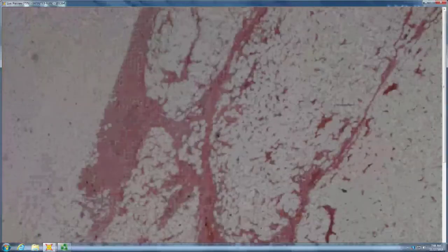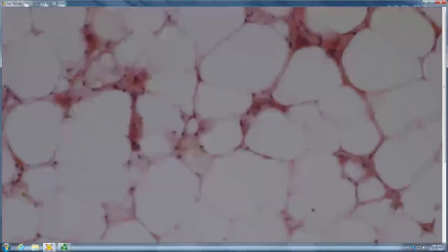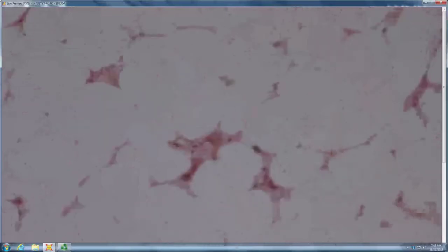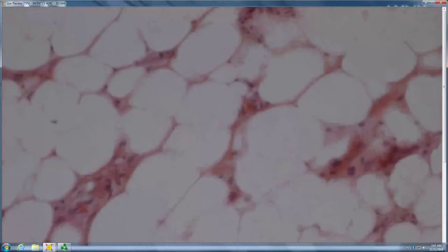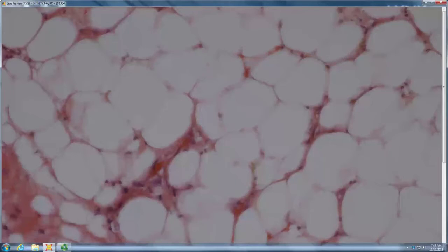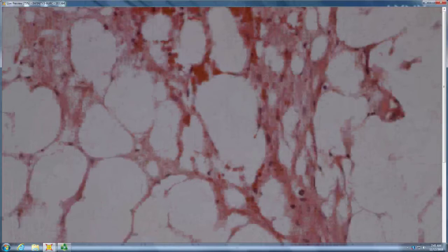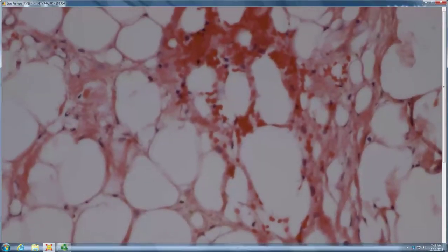Okay, so we have no overlying skin. We have the subcutis. They all look relatively the same size, the fat lobules. There are some thrombi, and what I'm trying to get you to see is, is the overlying skin dead? The overlying skin actually has rock hard retiform necrosis.